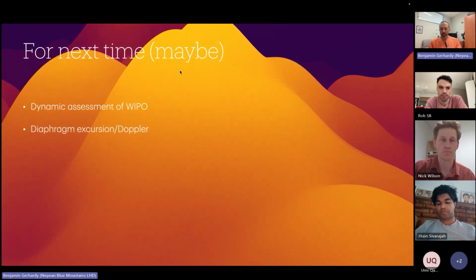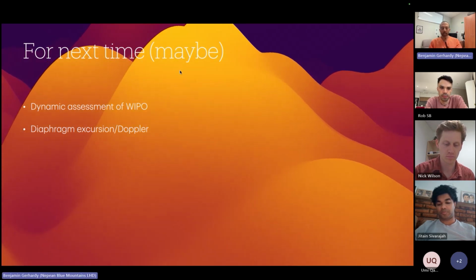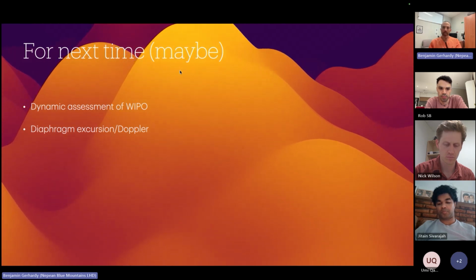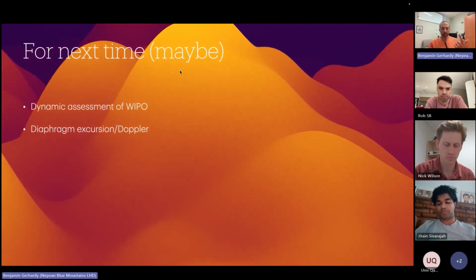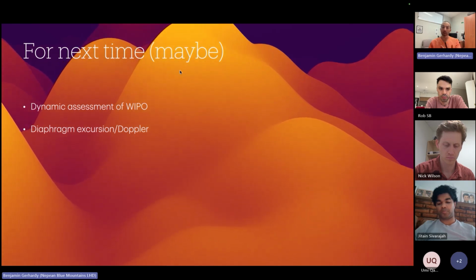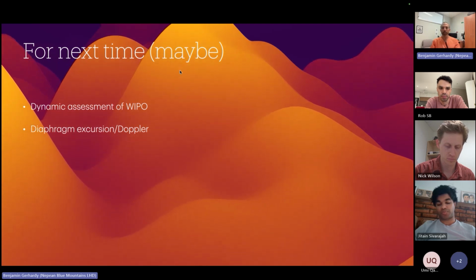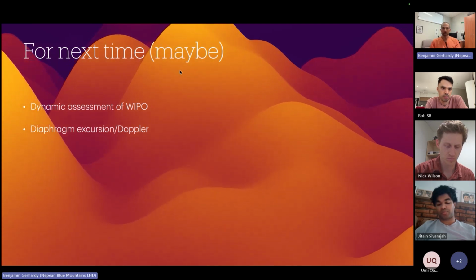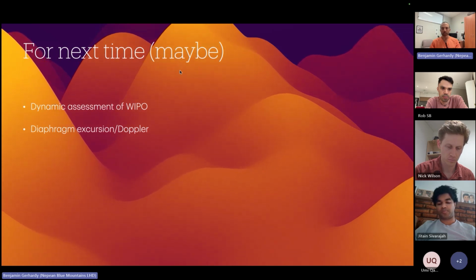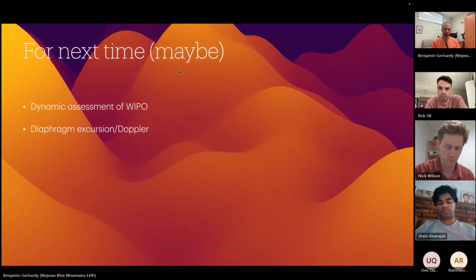Whereas if they looked and smelled a bit like infection and had clinical features of it, a normal X-ray, and I saw B lines, I saw subpleural consolidation, I wouldn't do anything further, just give antibiotics. When I have patients that are well from the end of the bed, so to speak, because these people come into ED all the time, and I find stuff like this, then I'll give them antibiotics, send them home, and happily call it. All right, great, thank you.